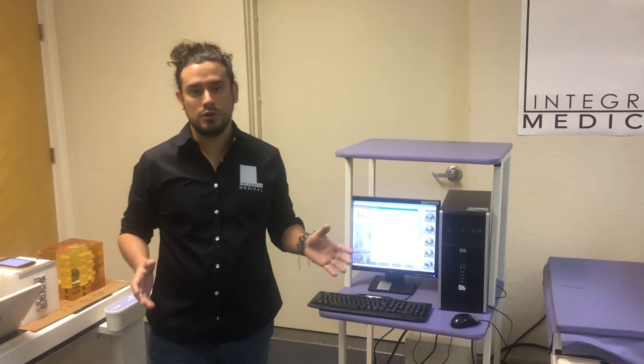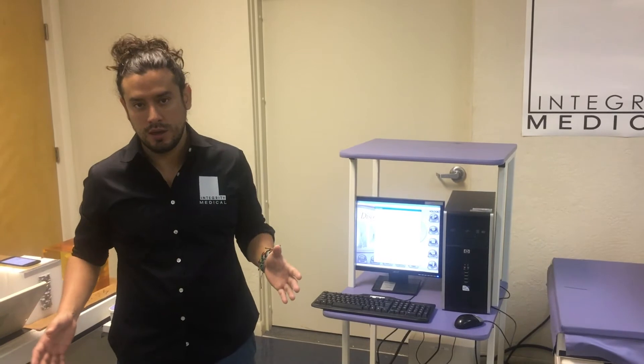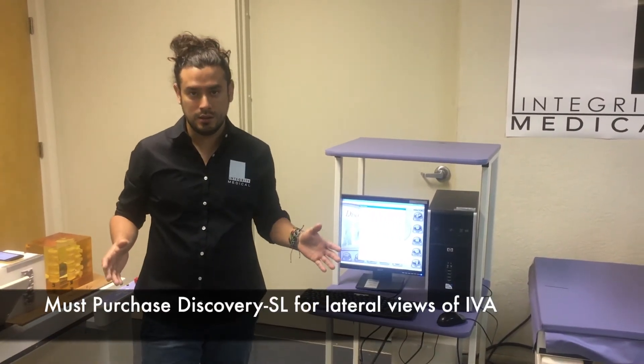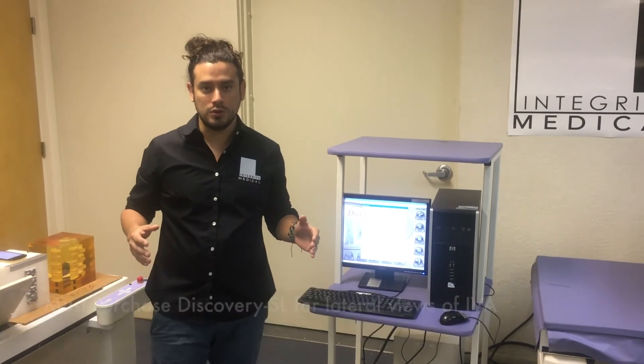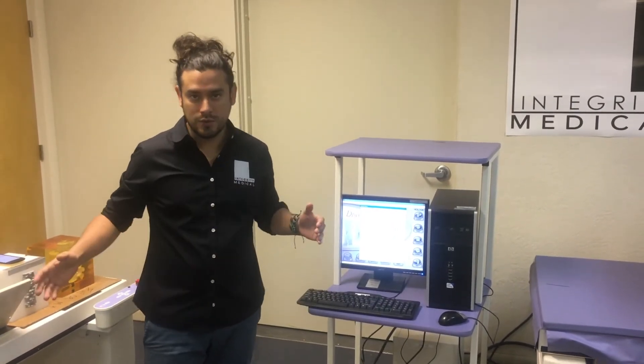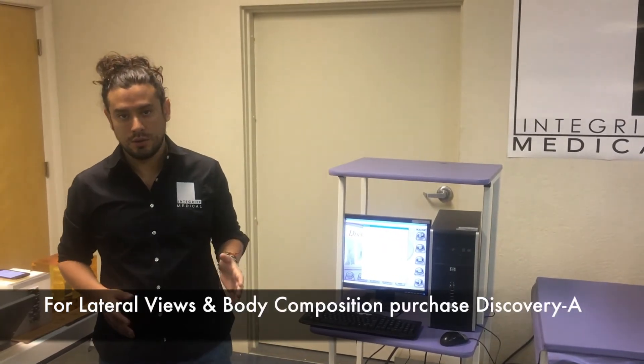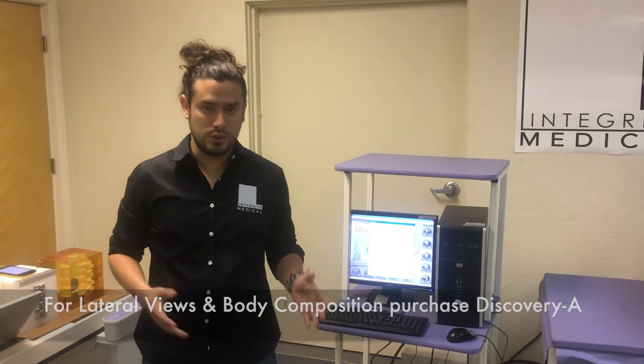If at some point you need to do lateral views of IVA, you will need the next model, which is the Discovery SL. If you need lateral views of IVA plus body composition, you will have to get the highest model, which is the Discovery A, also used for research.